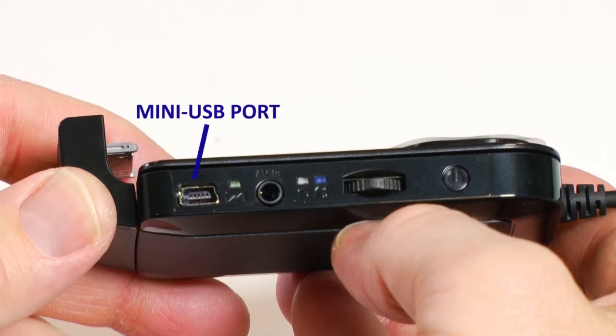This is the mini-USB port. It is used for charging the Cinemizer battery and updating the firmware on the Cinemizer.